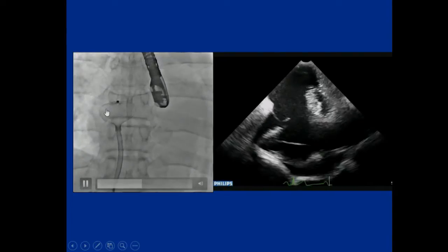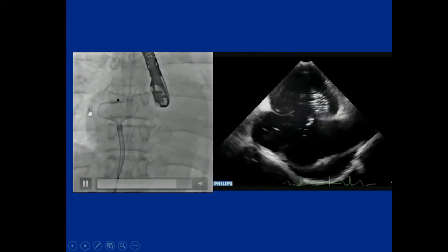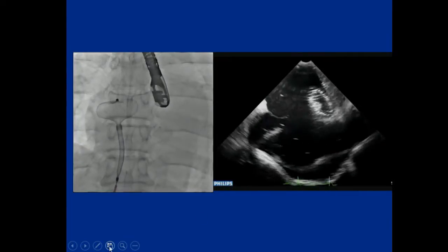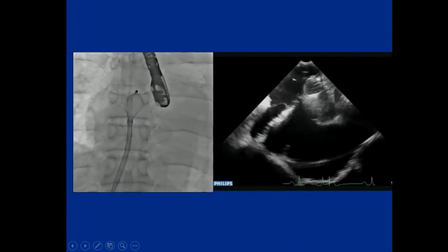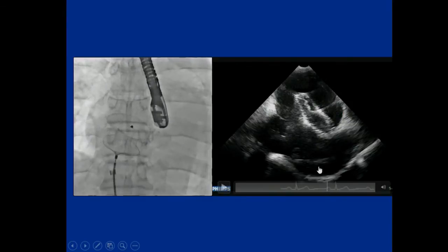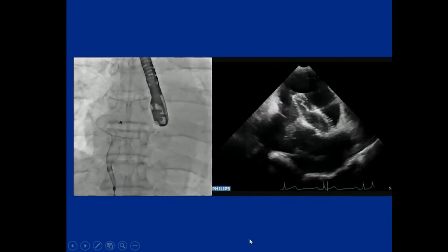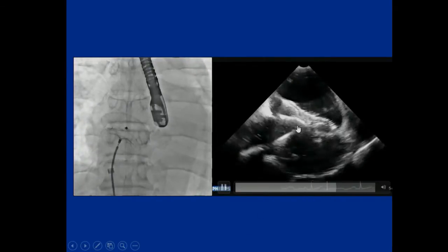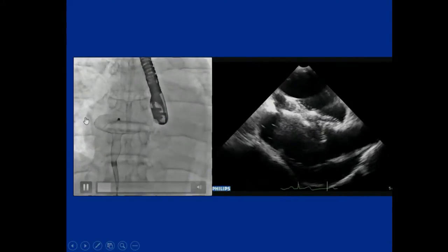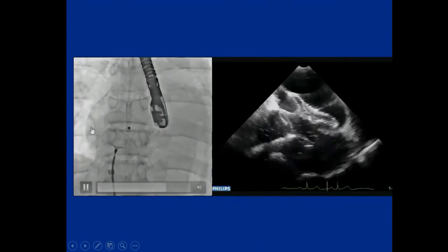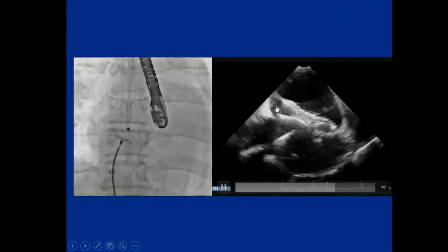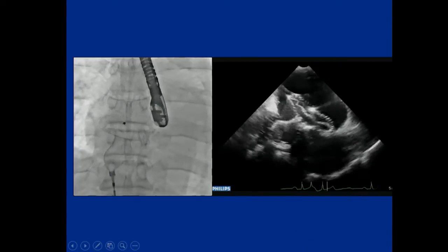Many operators approach from the right upper pulmonary vein, close to the right upper pulmonary vein — this is one of the tips for procedural success, especially for aortic rim deficiency. Echo confirms the site where the device is opened, because the operator looking only at the fluoroscopic view cannot see where the atrial septum is. The operator watches position using transesophageal imaging, so echo guidance is very important in the cath lab.